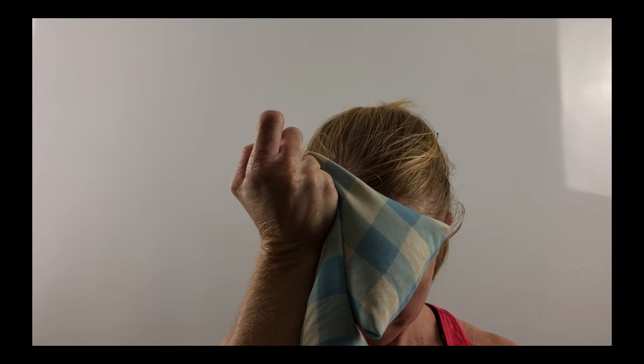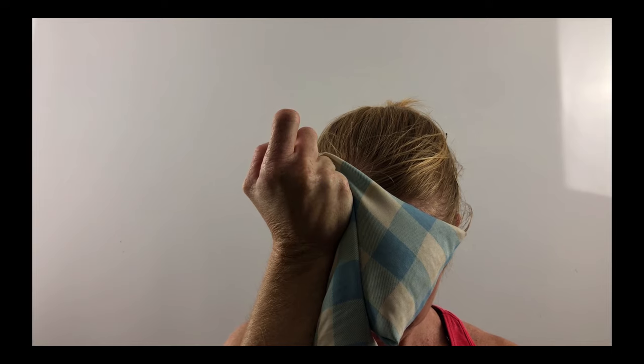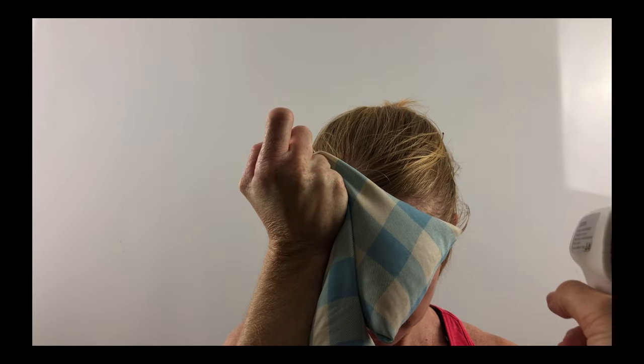For demonstration purposes, we had the candidate hold a hot pack up against her head. When a sample is taken and the temperature indicates a fever over 38 degrees, the gun will flash red.